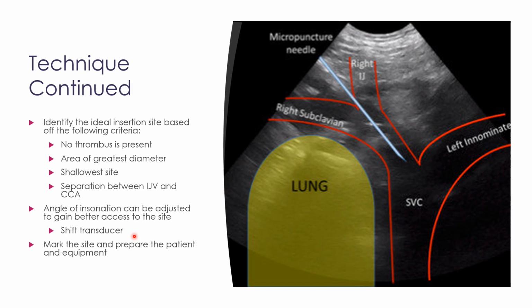And then once you've finally decided that you have the site where you're prepared to insert the needle, you can use a Sharpie or whatever you want to mark that site, so you don't lose it while you're prepping your patient and your transducer.